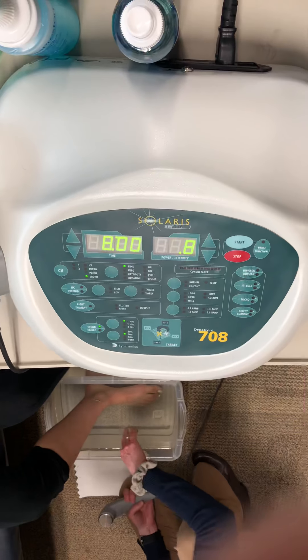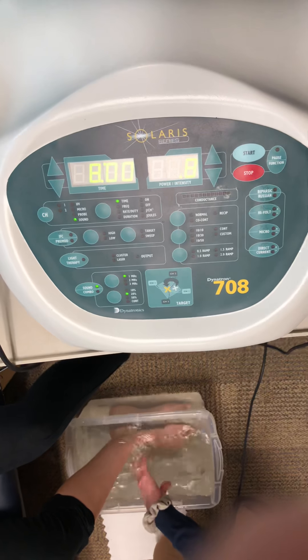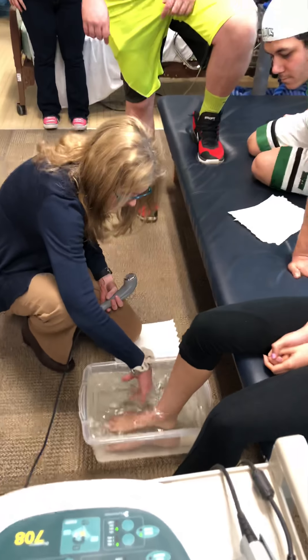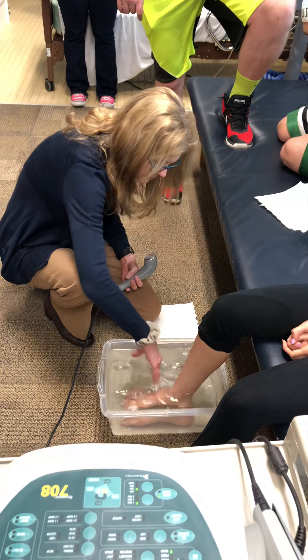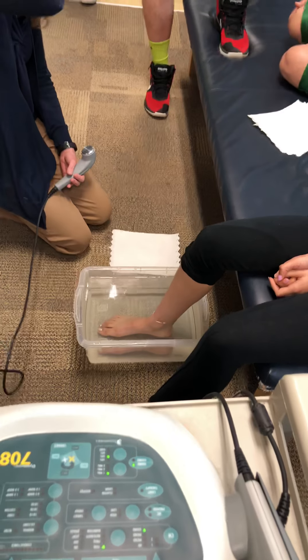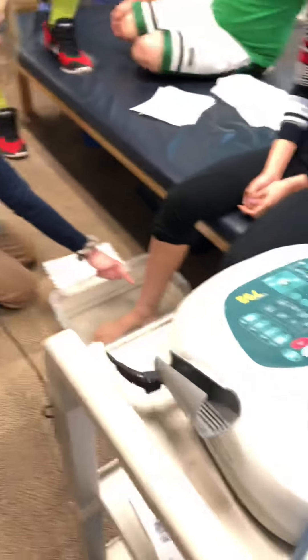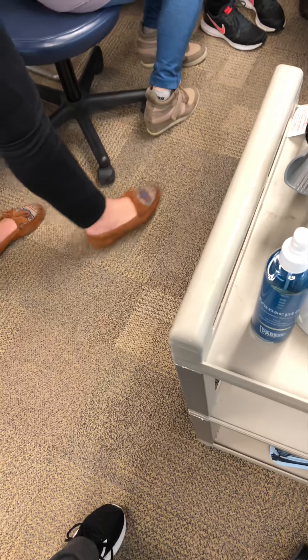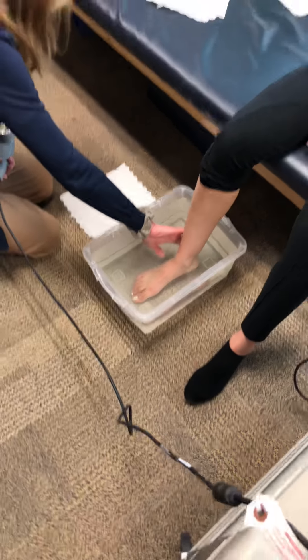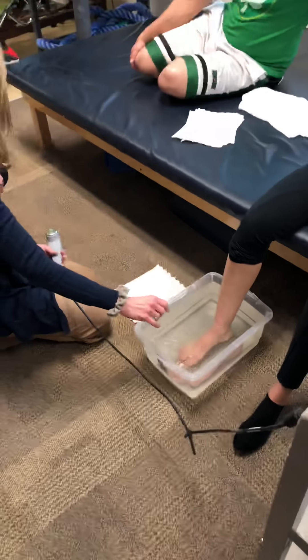I'm going to show you air bubbles — I'll try to splash this around and see if I can create air bubbles on your ankle. You can see the little bubbles posterior to her malleoli. If you have a lot of those — like some people do this in a whirlpool with agitation — the air is going to repel the ultrasound back. So you want to wipe them off so she can receive the ultrasound. Just take your finger and wipe them off and they come right off.